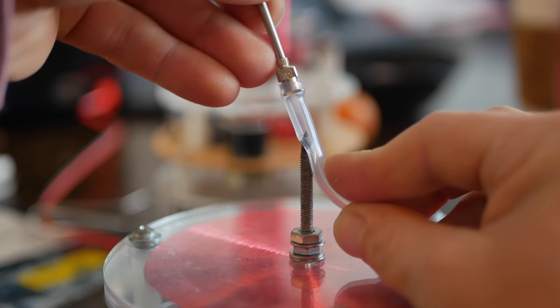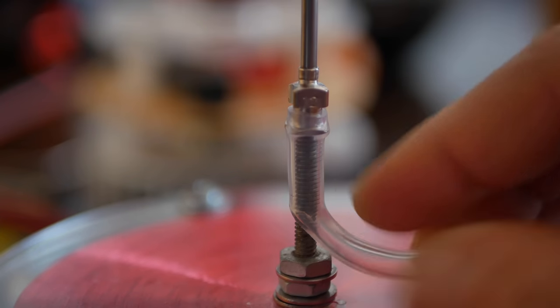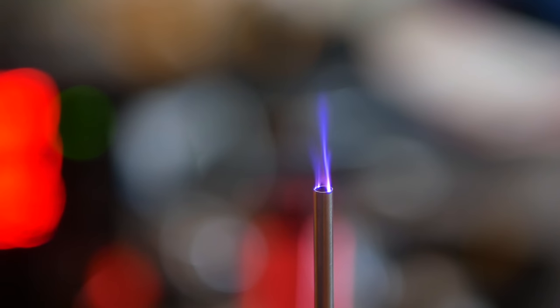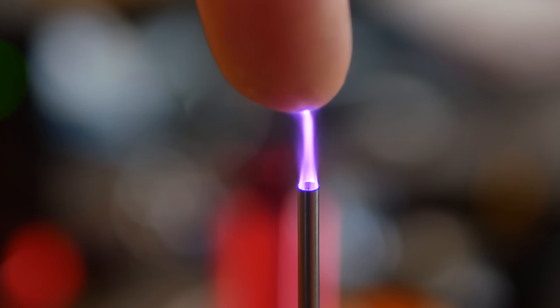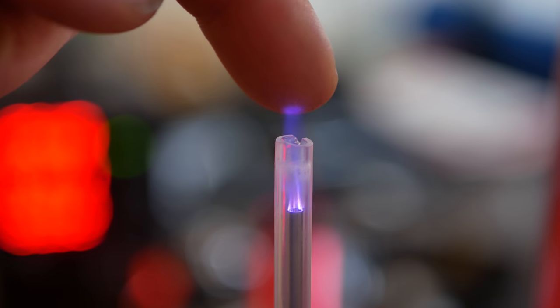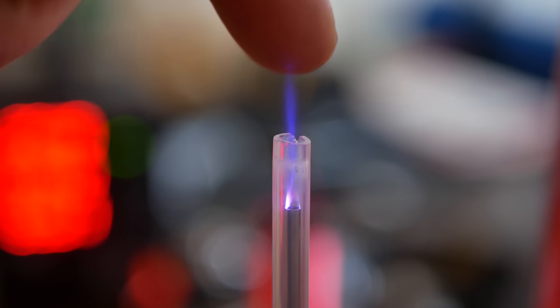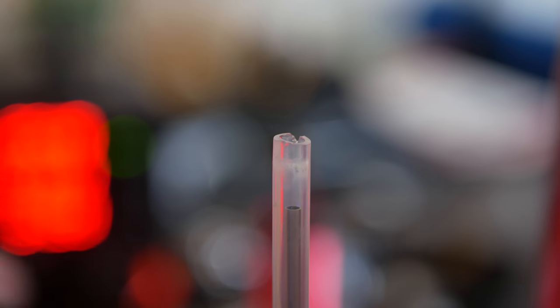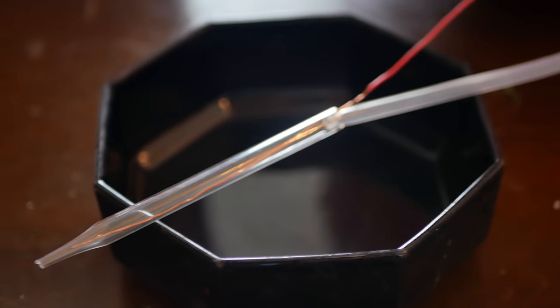My second setup used a 12-gauge needle attached to the end of the helium line. The electrode was stabbed through the side of the tubing like before, but this time the metal needle allowed for a nozzle to be much further away from the solid-state coil. With power and helium flowing, it lit up. Though this produced corona and ionized gas, it really wasn't cold plasma. The gas was too bright, and my finger was getting really hot, so a step in the right direction, I guess?